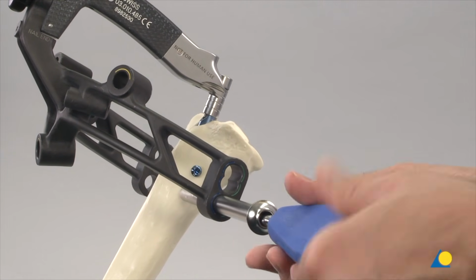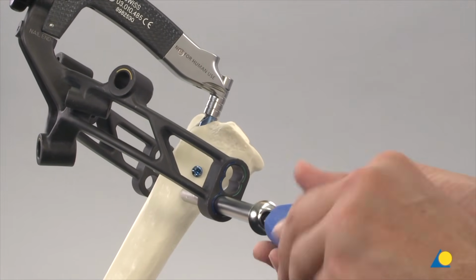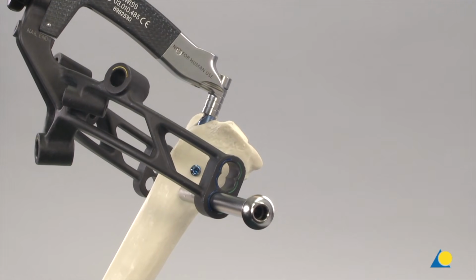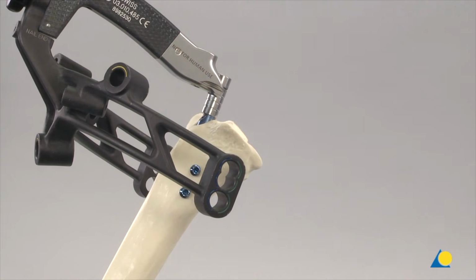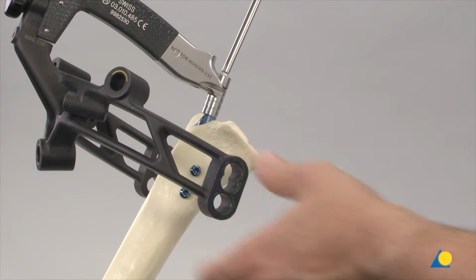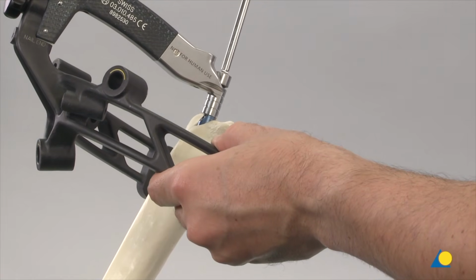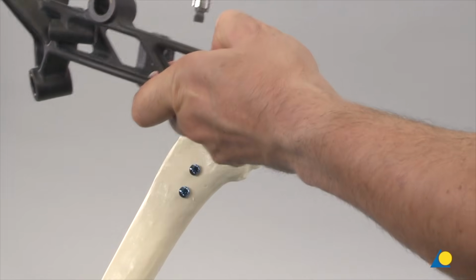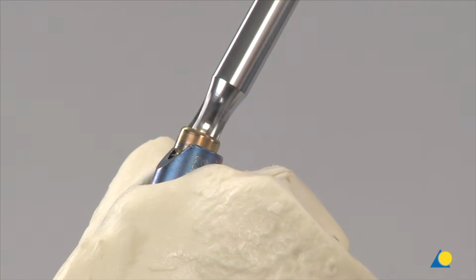Using the hole marked Stat 1 in the aiming arm, the screw insertion sequence is repeated for the second proximal mediolateral locking screw. The screwdriver, hexagonal, 8.0 mm diameter, with spherical head and T-handle, is used to loosen the connecting screw so that it can be removed together with the insertion handle and the aiming arm. The 0 mm end cap is inserted as described previously.